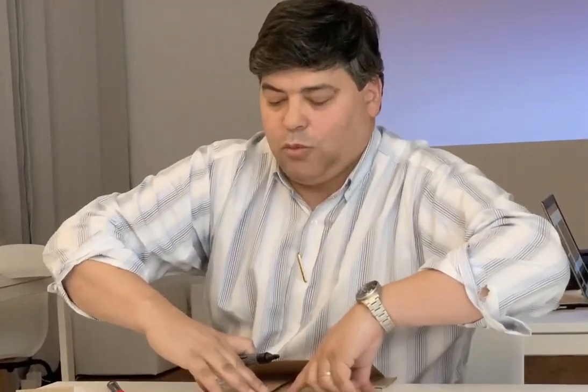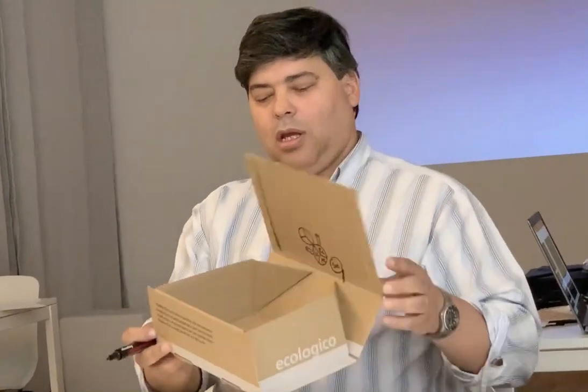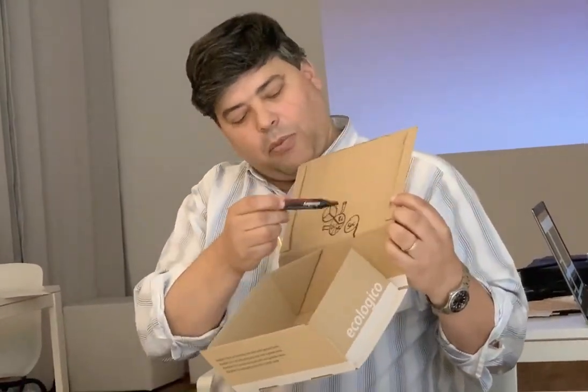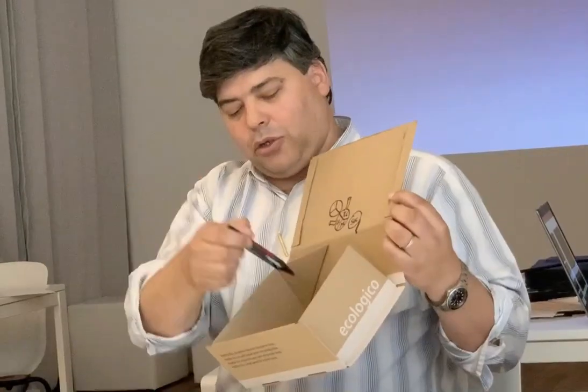Now this time, this is the upper part. We make this movement, and this way, starting to block here, this way, the anterior part and the superior part. Now we're going to create the interior part of the heart. To make it easy, I make it this way.